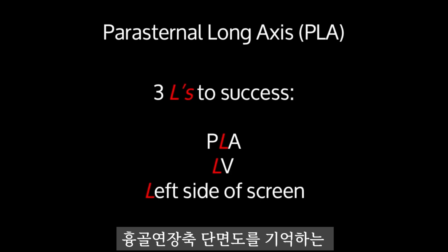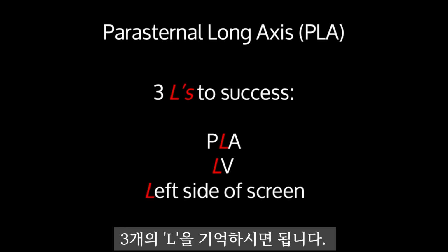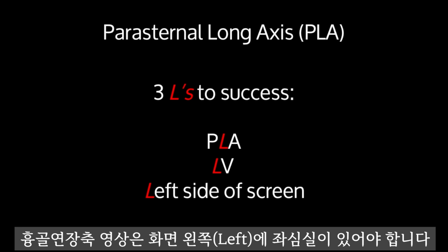So I told you I would give you an easy way to remember the parasternal long axis view. You can remember it by the 3 L's to success. The parasternal long axis should have the left ventricle on the left side of the screen.